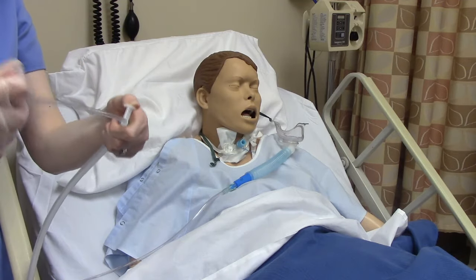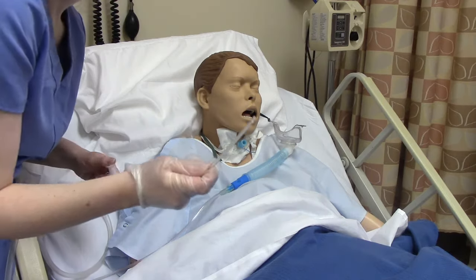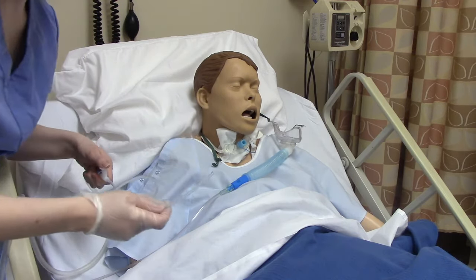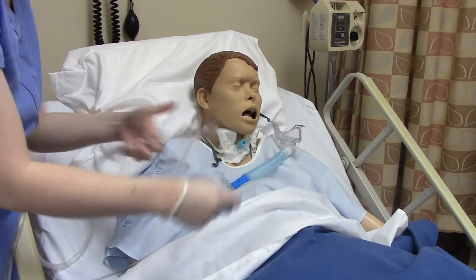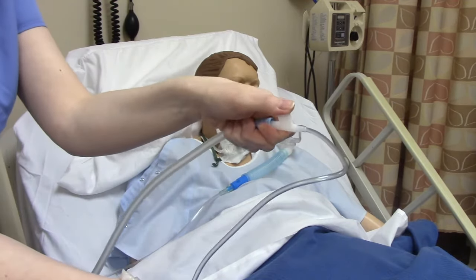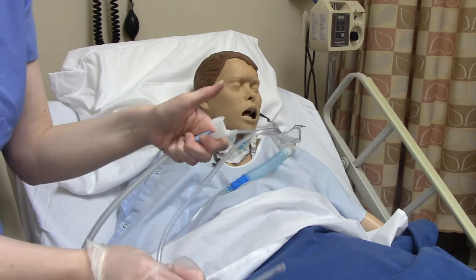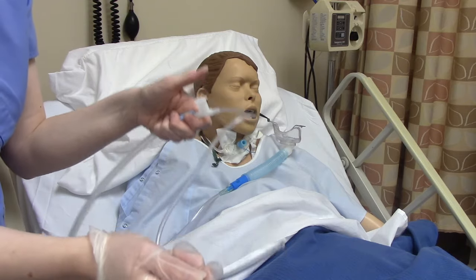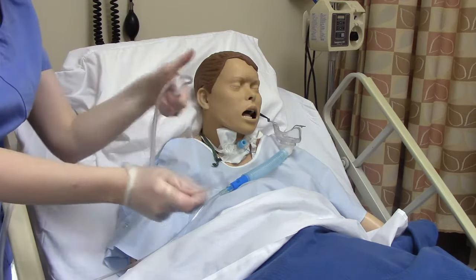We can hold the trach collar in the non-sterile hand and then insert the catheter with our sterile hand. When it comes to suctioning, you can do it with or without the inner cannula in — it doesn't matter. When we go in, we want thumbs up. We're not going to be pressing the thumb port because that's what provides the suction, and when we're suctioning we're temporarily restricting the patient's airflow.